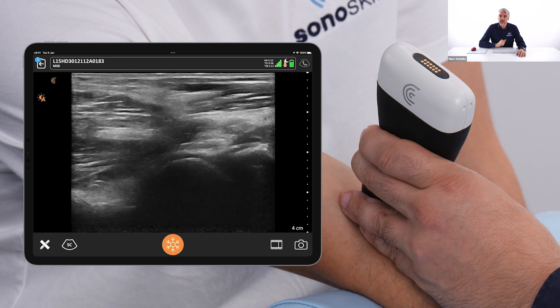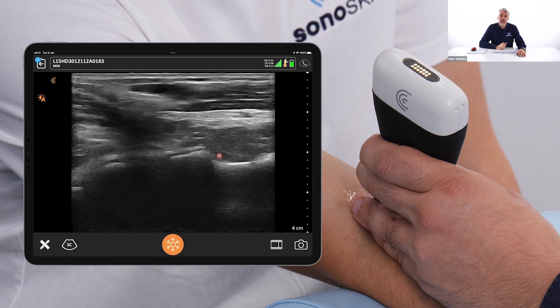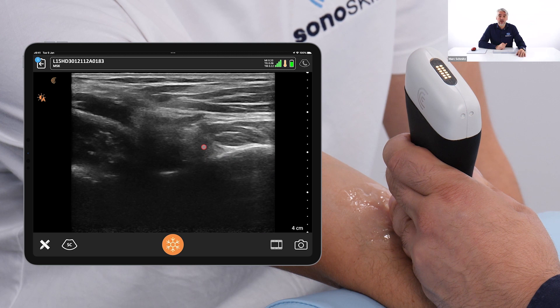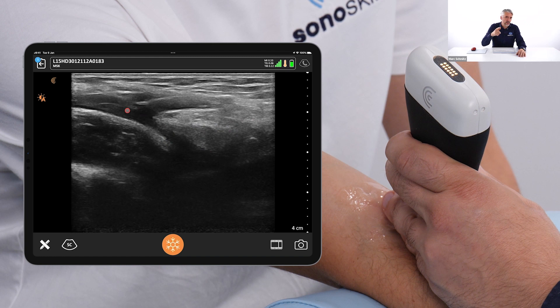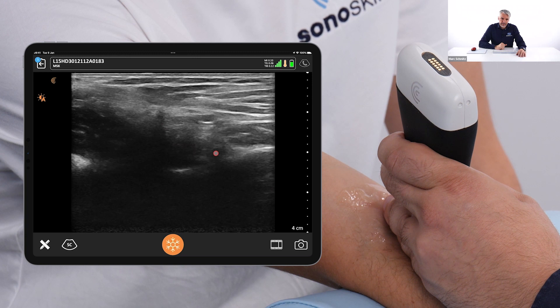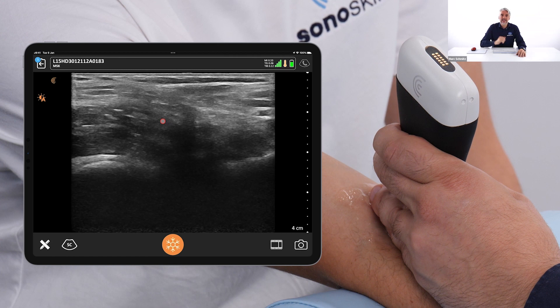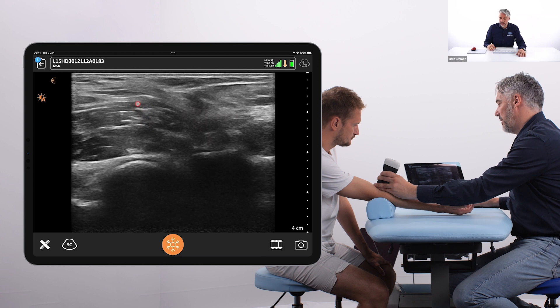Step three is the longitudinal view from the ventral approach. You can see the humerus, the humeral-radial joint, the radial bone, radial neck, radial shaft, and the radial tuberosity — which is only visible due to the supination of the patient. You can see a little part of the tendon insertion there, but it's challenging and not optimal. I have much better views on the distal insertion in the dorsal approach. In the longitudinal view, the brachial artery is very close, so if you are looking for the tendon and accidentally scanning the artery, move a little bit more lateral to find the distal biceps.